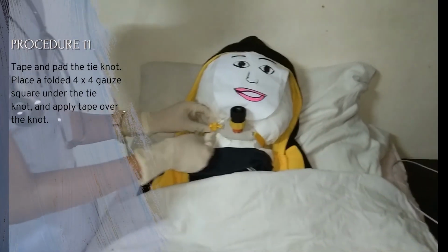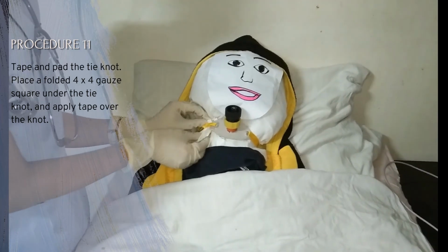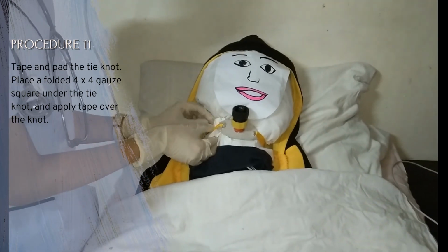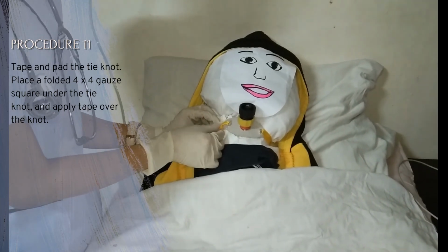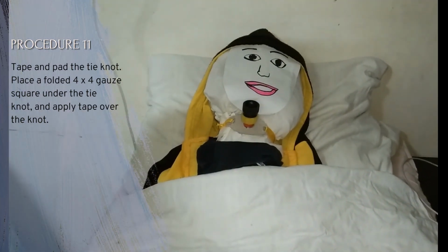Tape and pad the tying knot. Place a folded 4x4 gauze square under the tying knot and apply tape over the knot. This reduces skin irritation from the knot and prevents confusing the knot with the client's gown ties.